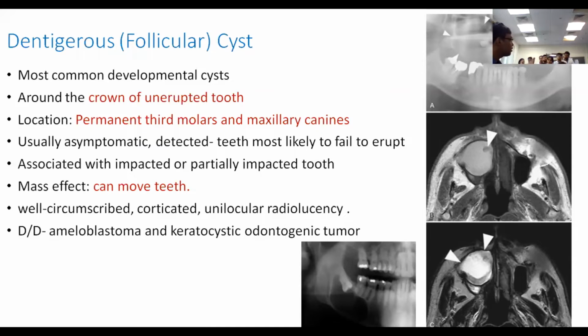All those can be seen in one patient as well. You can see them in isolation, or in association. They can grow a little bit more, and if they grow too much, they can displace the teeth. A radicular cyst does not do that; it will not displace the teeth. So it can grow and displace the surrounding tooth, and that's how you will diagnose it.